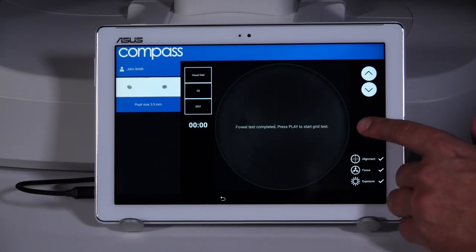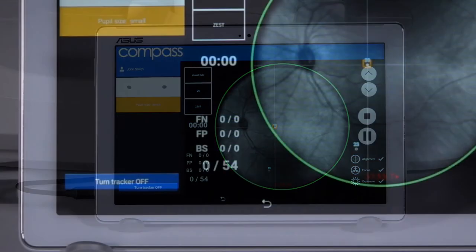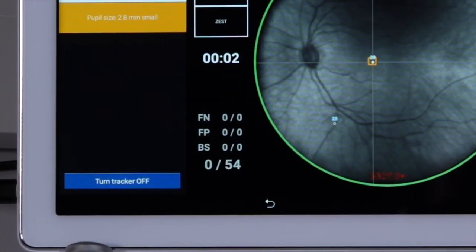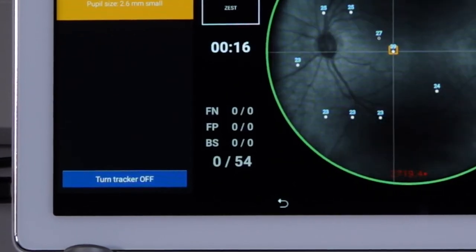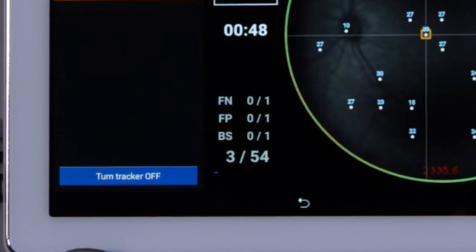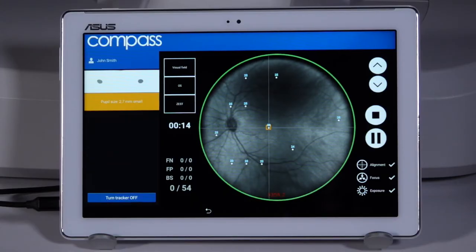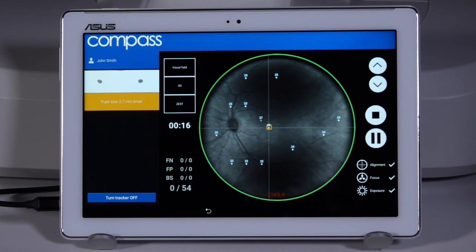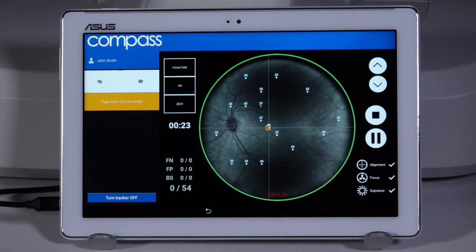The visual field pattern will now be presented. During the test, the results can be monitored to ensure the highest quality by reviewing the false negative, false positive, and blind spot responses as they occur. The green circle surrounding the live infrared image ensures the compass is compensating for fixation losses and adjusting the projection of the pattern.